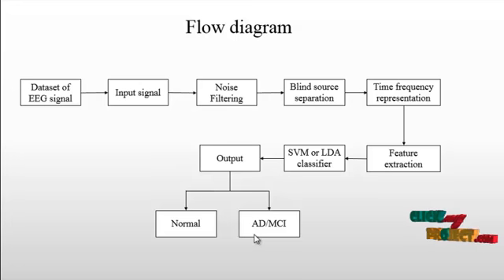So whatever it may be, the classifier gives the output. Finally, we determine whether the EEG signal is a normal signal or an abnormal one.